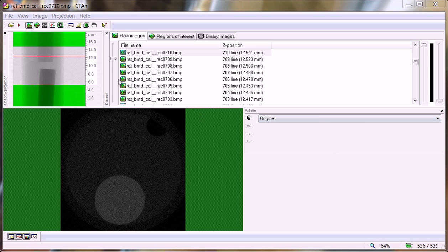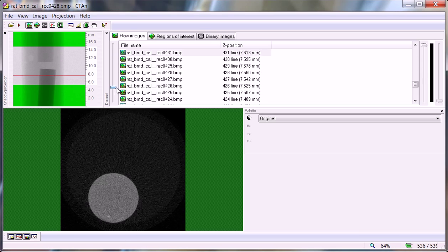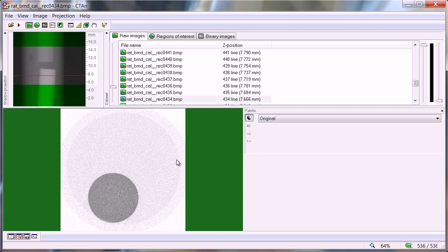We are looking here at the calibration scan of two BMD calibration rods as supplied by SkyScan — epoxy resin rods containing calcium hydroxyapatite powder embedded at concentrations of 0.25 in the lower density rod and 0.75 grams per cubic centimetre. If I invert the image we can see the water in the tube, the plastic walls, and the two calibration rods.